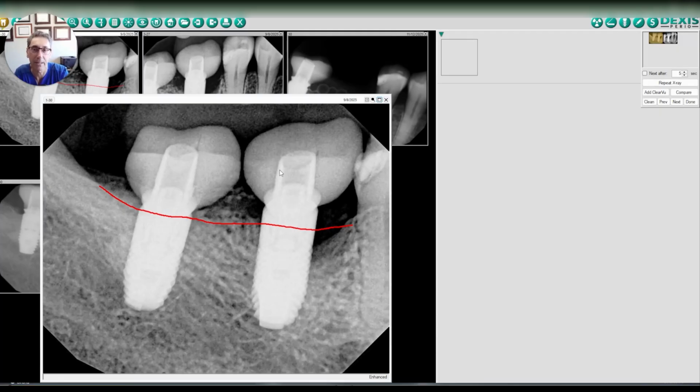If we sink it in, then we have a good amount of bone, soft tissue, and keratinized tissue around this implant, so we can preserve the bone, we can save the bone, we can protect the implant in the long term. So the implant is in, and now we need bone grafting.